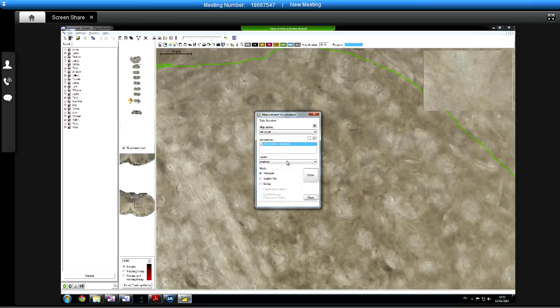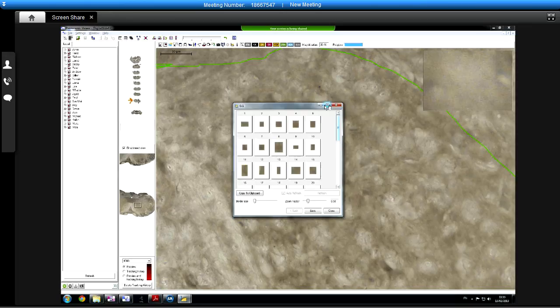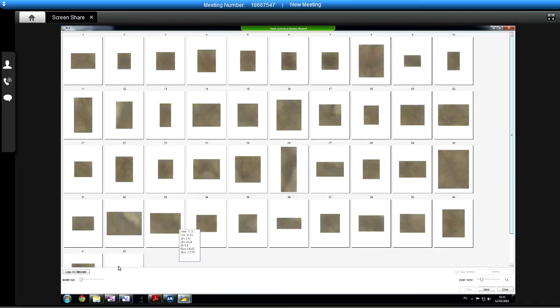And then what I did was I increased the border size because that puts more of the surrounding area around them. And then when I put my mouse over them, it shows me that other information. So I would say for tweaking, the only one that is really useful here is the area. These other ones can be useful for something else, which we'll come on to.